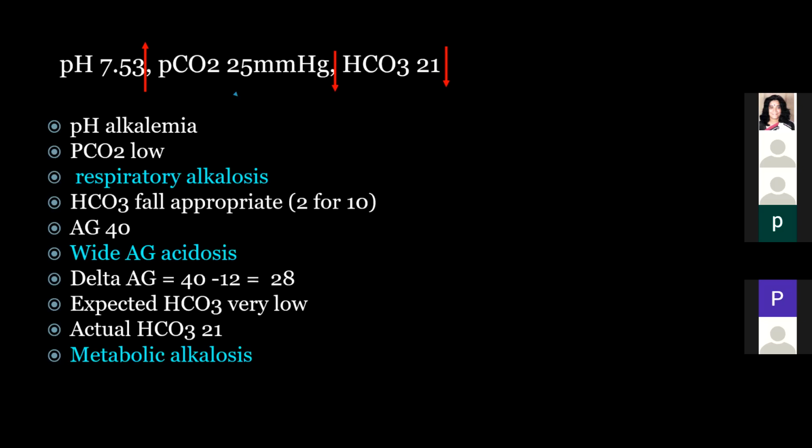How would it help in what way? There's a hypochloremia and hypokalemia both. One thing is that when you have a mixed acid base disorder, these urinary values may become much more difficult to interpret as opposed to that simple metabolic alkalosis which we had earlier, which did not have any other acid-base disturbance.